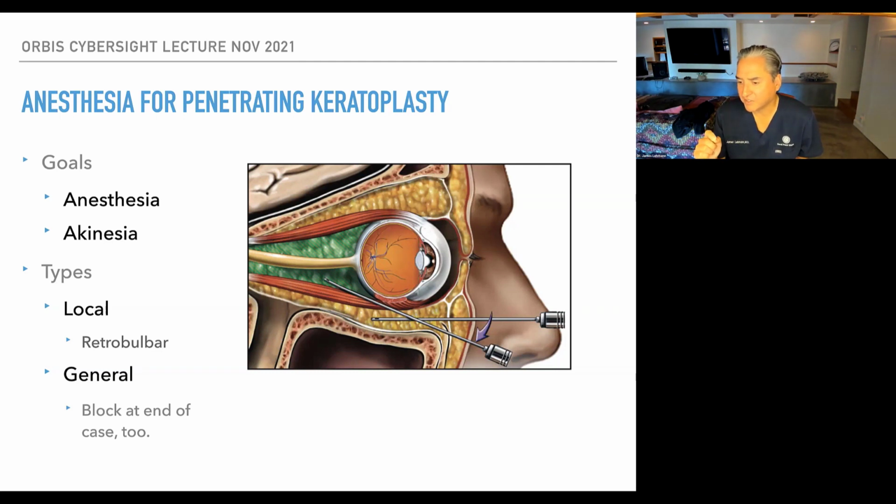There's a question by Dr. Katab. Can we use donor corneas with prior refractive surgery? Yes, for endothelial surgery, but I would not use a post-LASIK cornea for a PK or a DALK. I would use one for EK, like DSEK or DMEK.